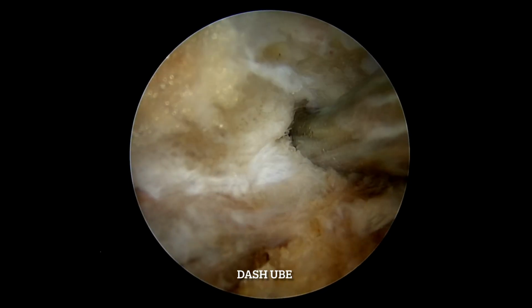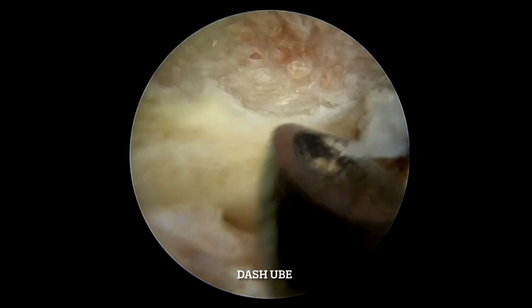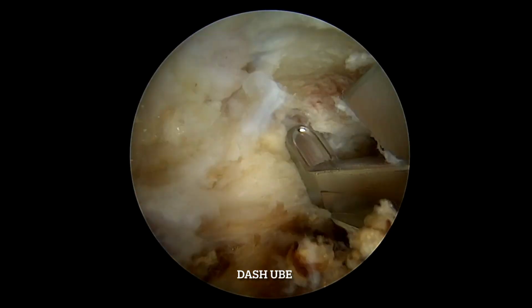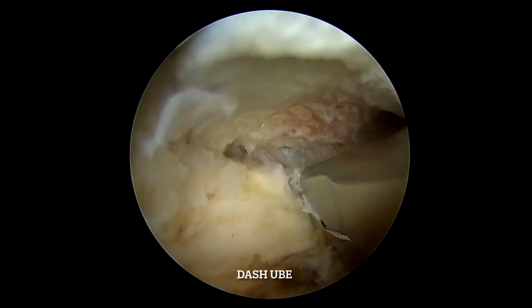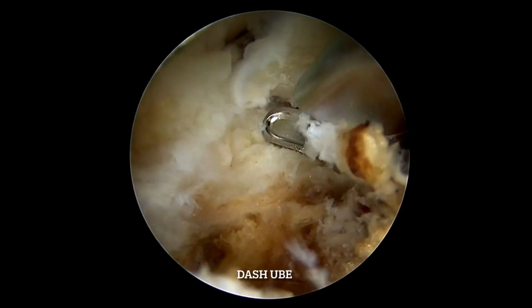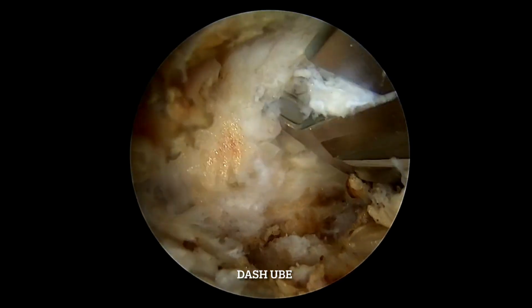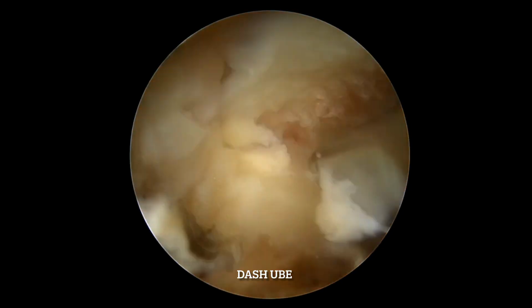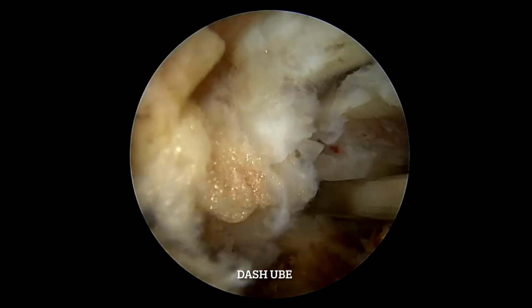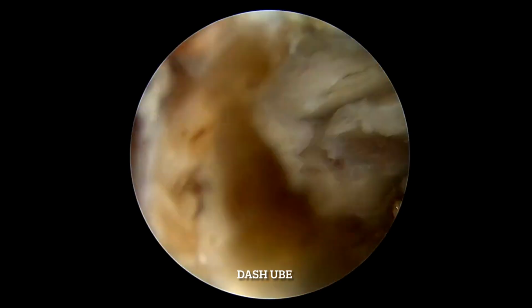I'm trying to drill, I'm trying to negotiate to the foramen. The first thing is I should identify the exiting root. You have to understand that para UBE or transforaminal UBE is an outside-in technique. So I'm hitching on the pars area. You can very well see the joint gap. This is the SAP, the tip of the SAP. You need to drill the tip of the SAP to widen the area.